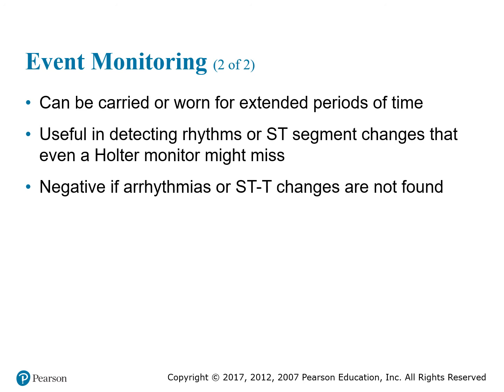This is like the last resort for a patient who might be suffering from some type of symptom: event monitoring, where the patient controls when it records whenever an event happens. Now, like I said, they do have the one that can be programmed to constantly record at any given time, but the most effective one is when the patient can control the event monitoring.